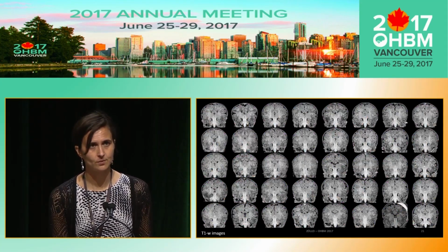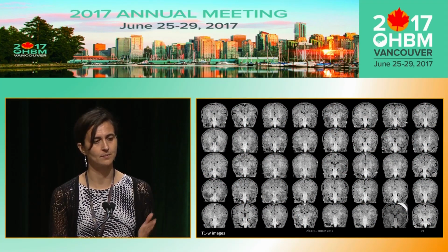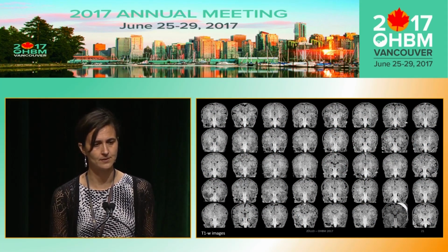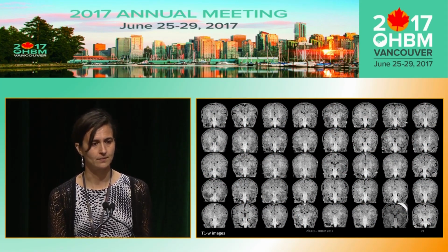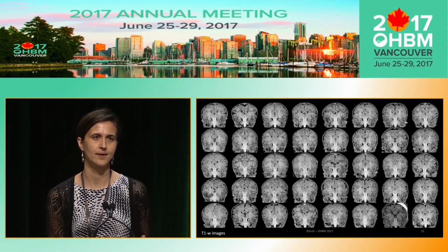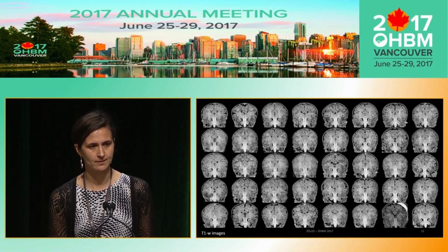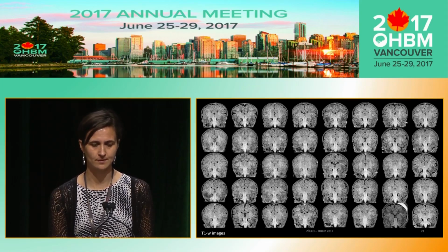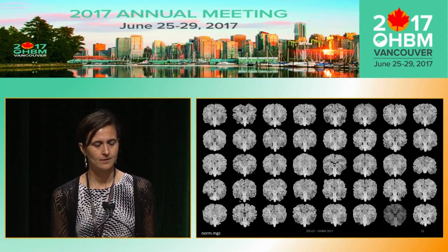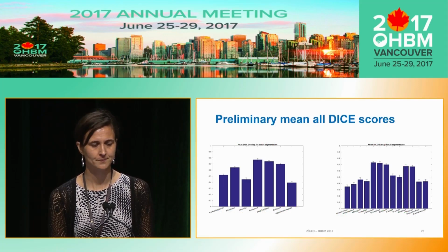As I mentioned, our tool works on T1-weighted images, so we didn't work from the T2-weighted images, but on the corresponding T1-weighted images. This is how the set of input images looks. Again, these data sets are affinely aligned here just for representational purposes in this unbiased spatial coordinate space. This is our skull stripping result and parcellation result.